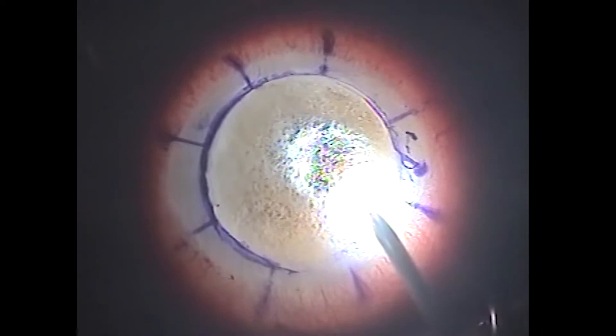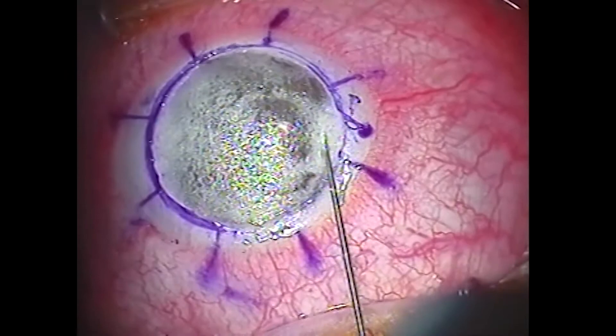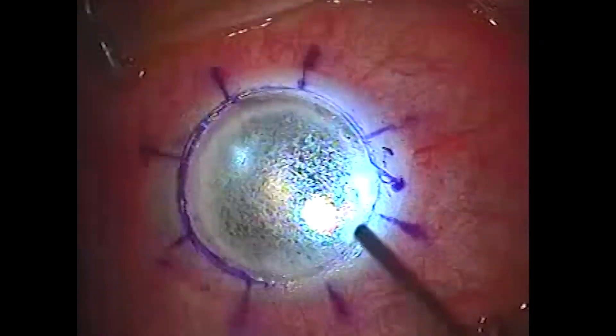In type 2 bubbles it helps us to decide whether to delaminate or not. In summary, this is a simple technique that can be performed with any kind of light probe available at the OR. It is extremely useful to avoid complications. We use this technique to know the type, location and size of the bubbles.